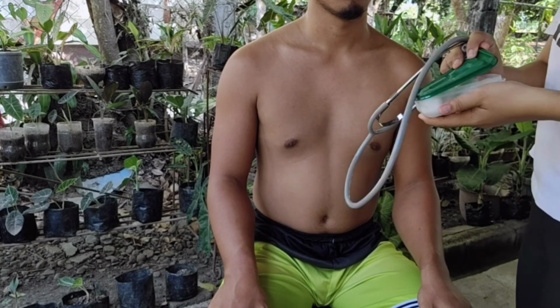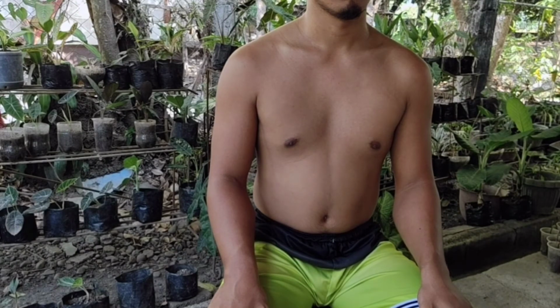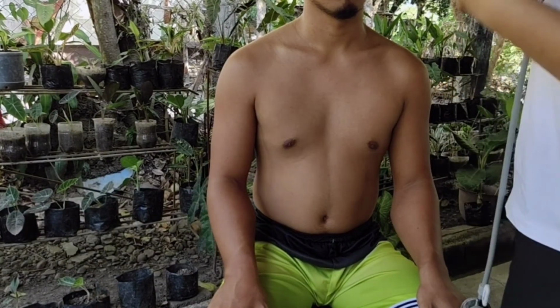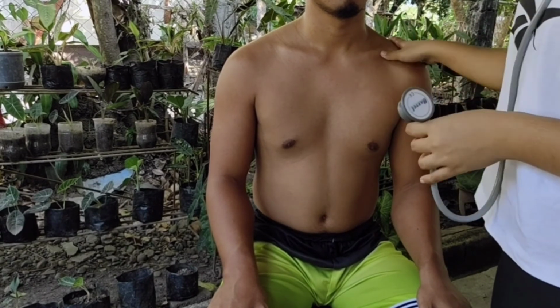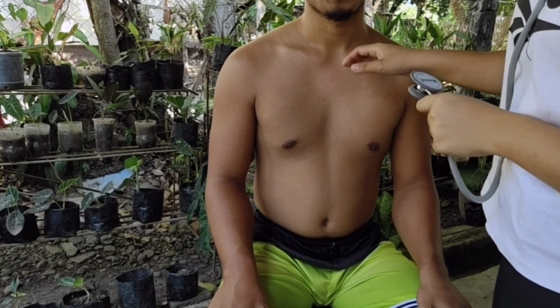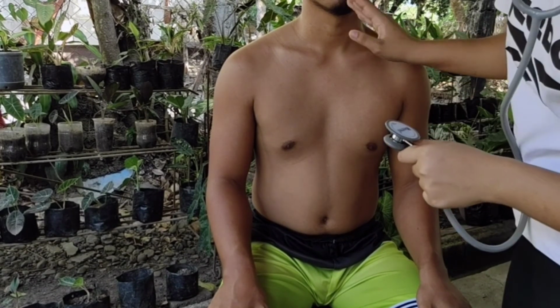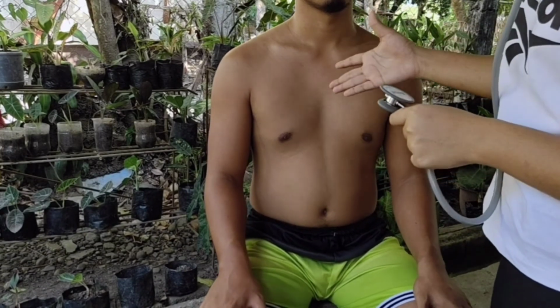I'll just wipe it with my cotton ball. In auscultation, we auscultate the anterior breath sounds, the adventitious sounds, and the voice sounds. We auscultate from the apices of the lungs, slightly above the clavicles, to the bases at the sixth rib, and ask the client to breathe deeply through the mouth.